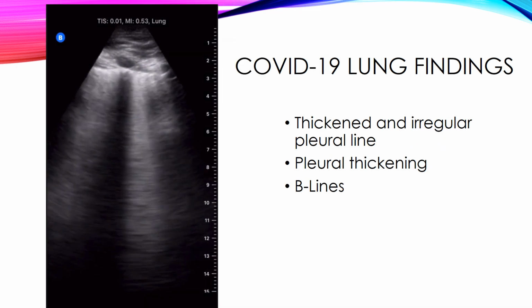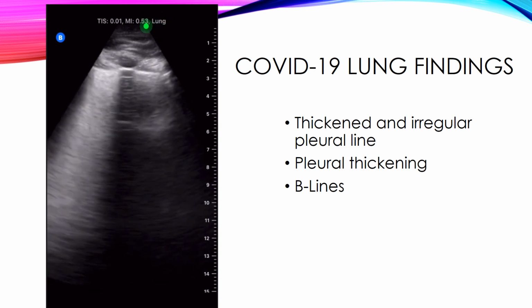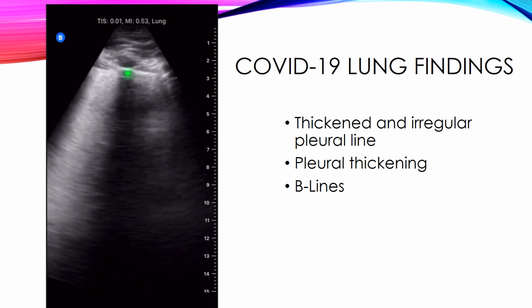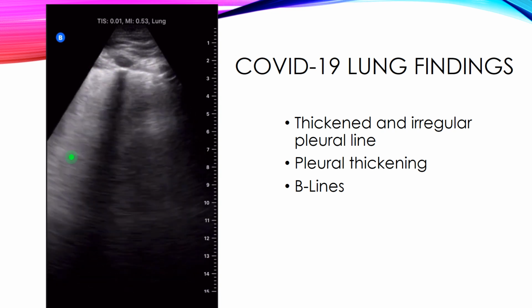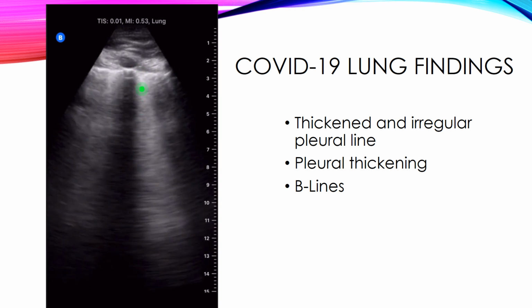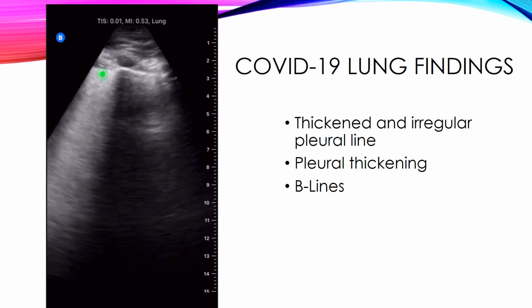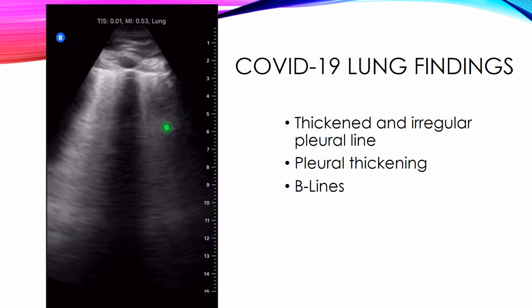This is a lung ultrasound study in a patient with confirmed COVID-19 infection. We're in a lung preset again. You'll see the rib and shadow here, with the thickened, irregular pleural line, and the adjacent rib here. This is the pleural line, and we can see that it's thickened and irregular. There are B lines, confluent B lines here, an isolated B line emerging under this interspace, and some pleural thickening at the affected areas with some adjacent normal pleura and A lines.